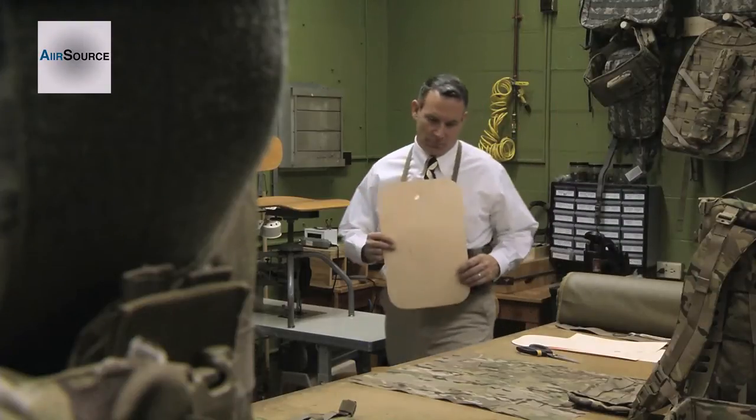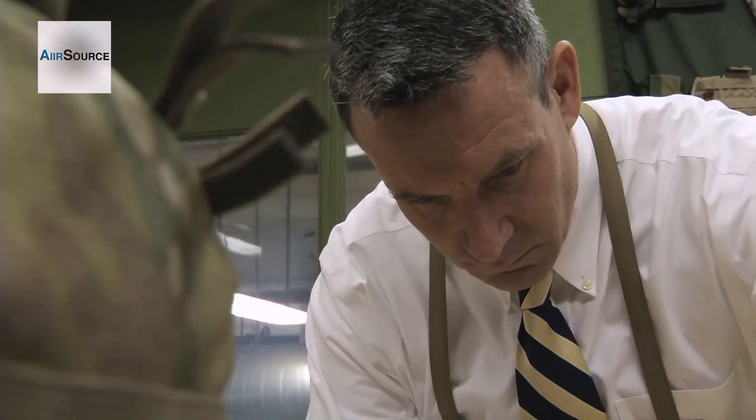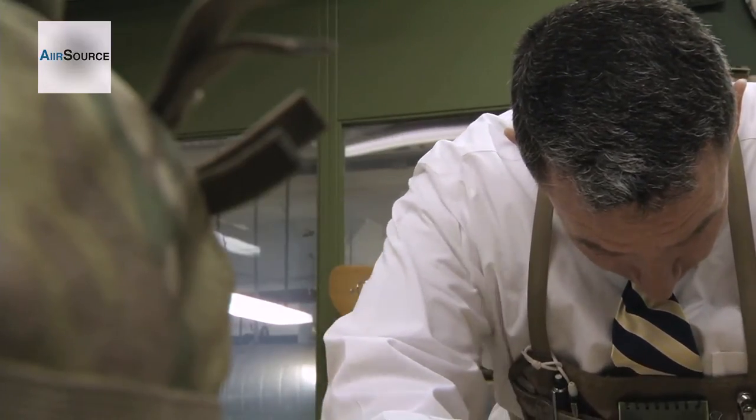One of the things that came out of my conversations with soldiers was: how do we improve the current individual first aid kit to make it more streamlined, more compact, and keep that accessibility piece?